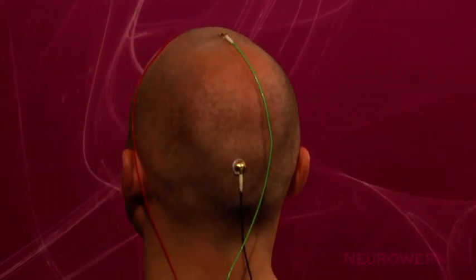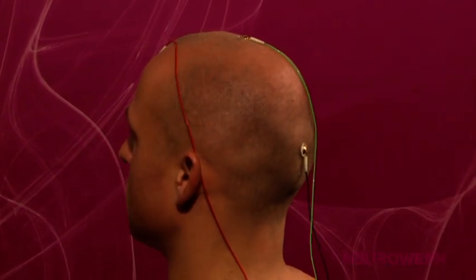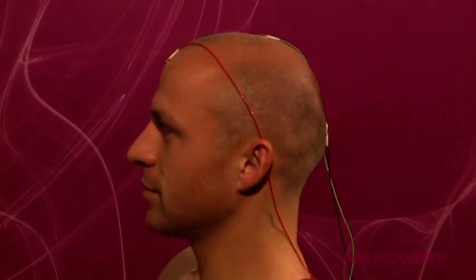To realize good recording results, attention should be paid to ensure that the contact resistance between the scalp and the electrodes is less than 5 kΩ. The grounding can be attached to the wrist or on the CZ electrode position.